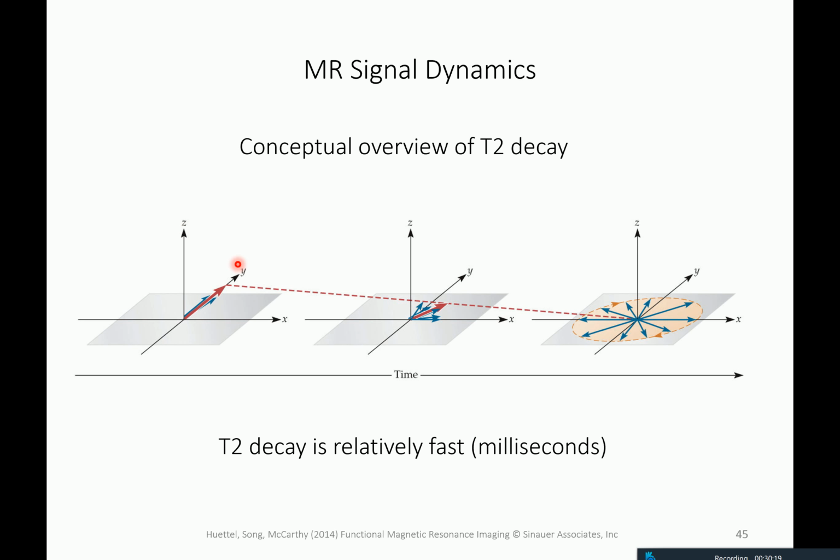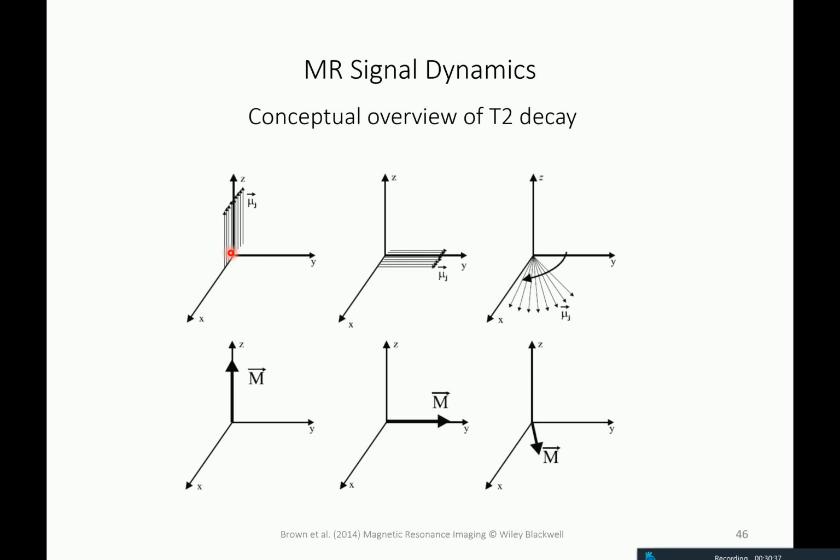So, for example, in our example, they would all go into the Y direction if they didn't have this kind of distraction from each other. Yeah, and in the beginning they are all in phase, that's the idea. I think I have another picture here, so this shows the same thing.